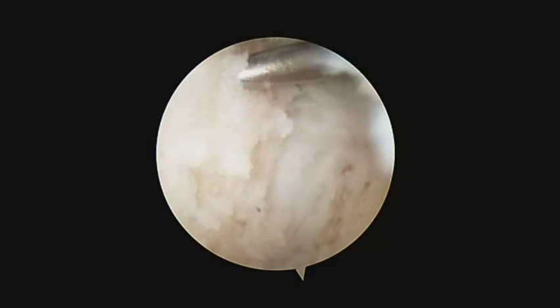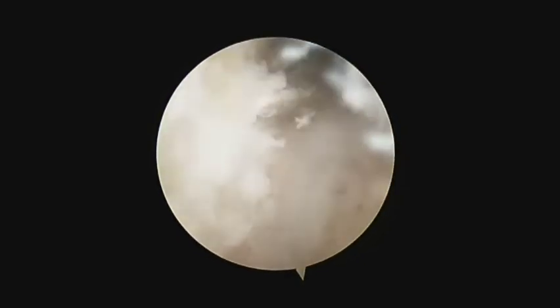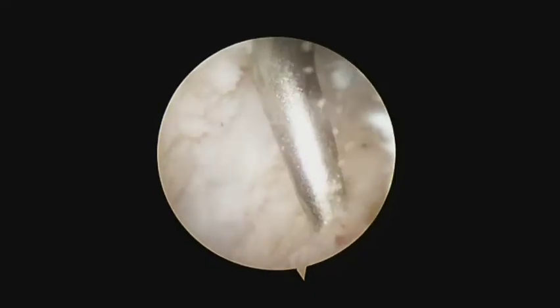After the fusion surfaces are prepared, the tourniquet is released and bleeding should be observed at the microfracture sites.